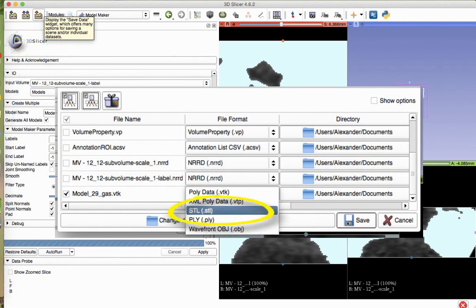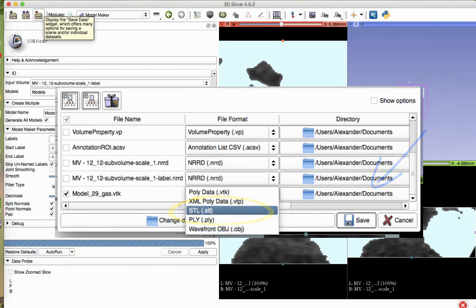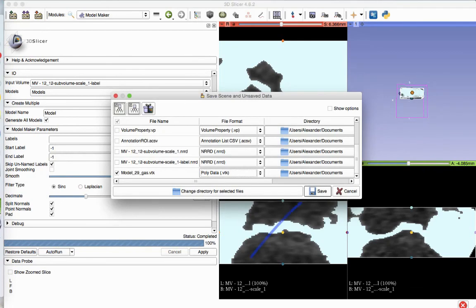You can also change the name of the file and directory by clicking in the directory column in the row of the polydata file. None of the other files are required for printing and can be unchecked. After selecting the directory and giving the file the name of your choosing, the process is completed. You now have an .stl file that can be 3D printed.